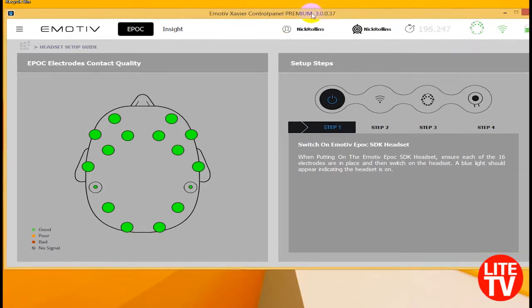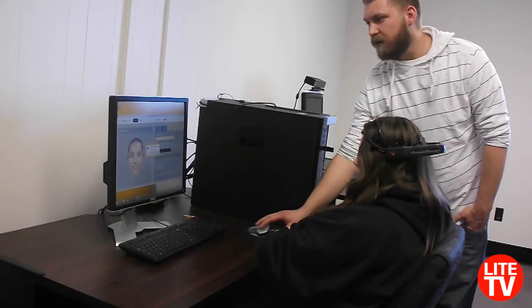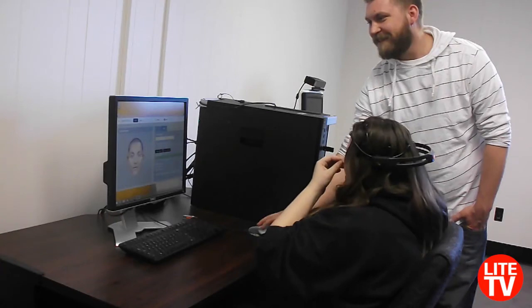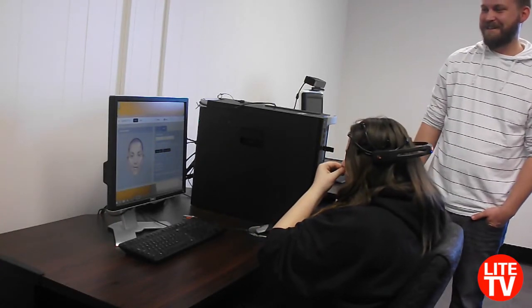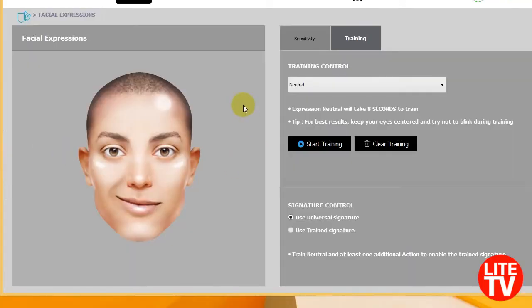So first thing I want to show you guys is over here in the detections. You can do some pretty cool little things. Here. That's creepy. That's really creepy. I don't like it. It's creepy.